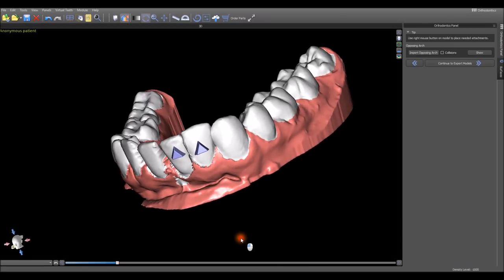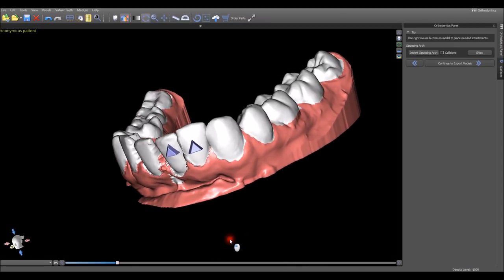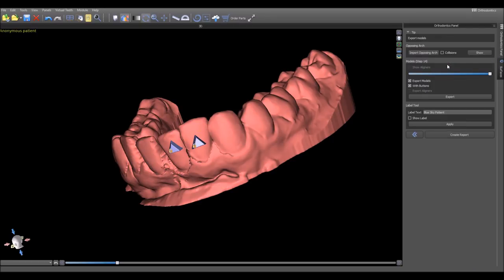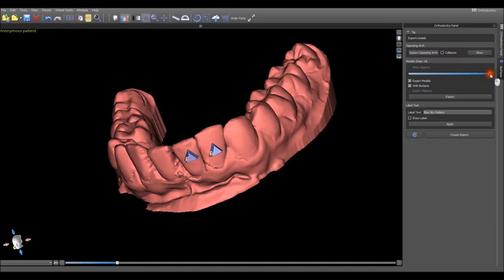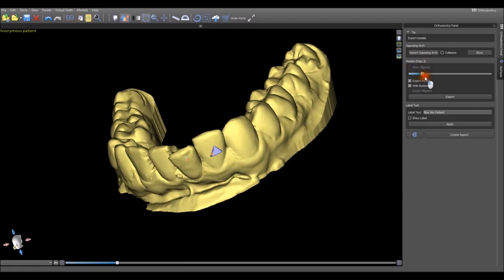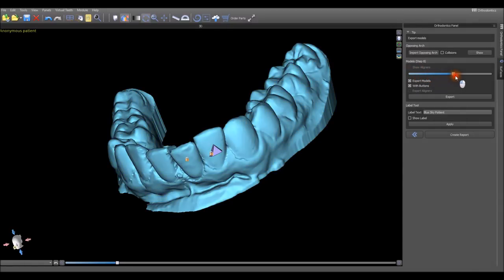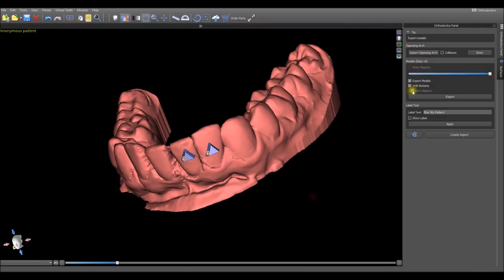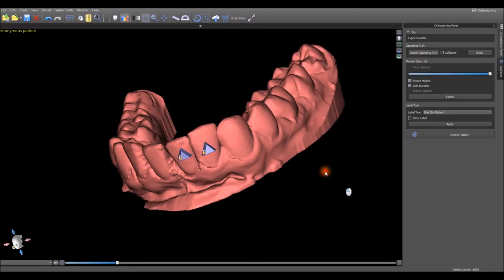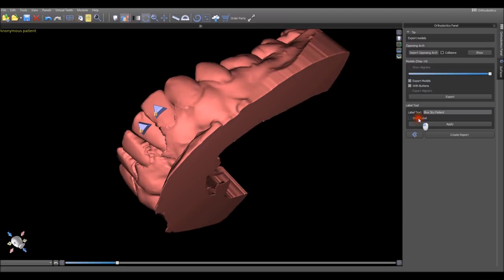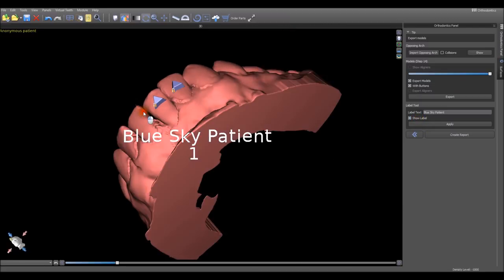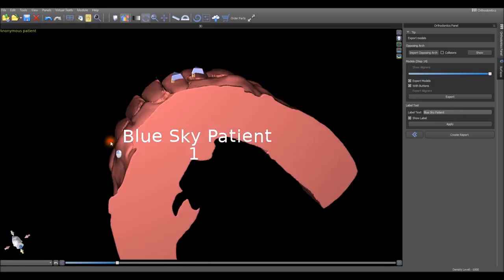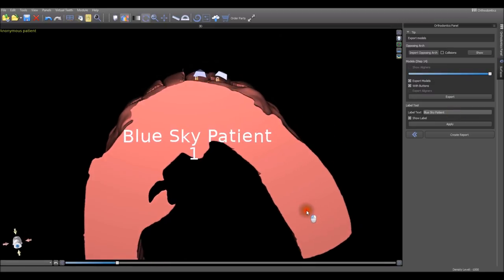Now we've positioned the teeth, we've added the buttons, we're up to exporting the models. We click on continue to export models. We're able to use the slider to see all of the different models that the software is going to export for us which can be used to create aligners. We're going to choose the option of exporting the models with buttons on them. Before we click the export button, we're going to add a label and we can change the label to any text that we want and the software numbers the models accordingly.